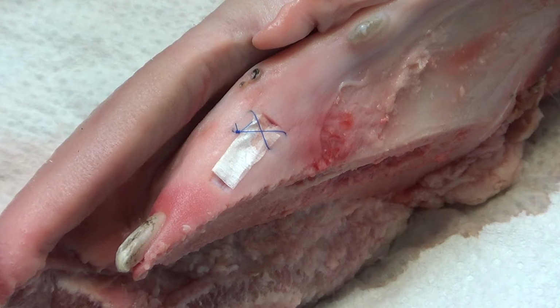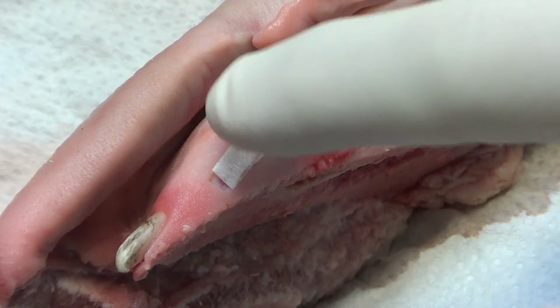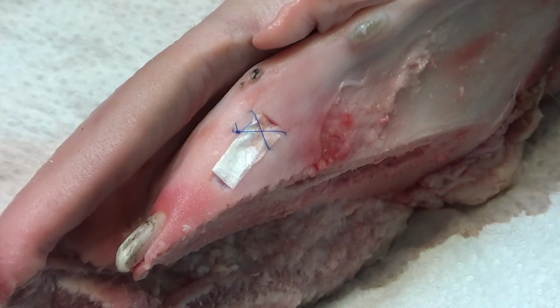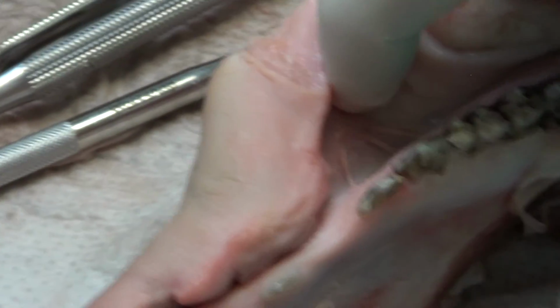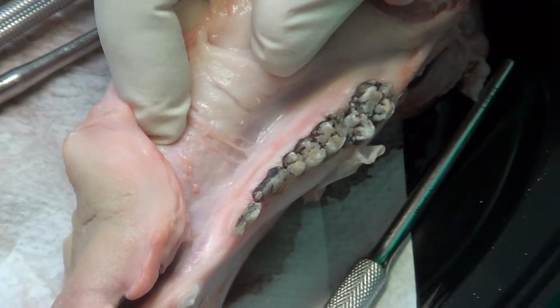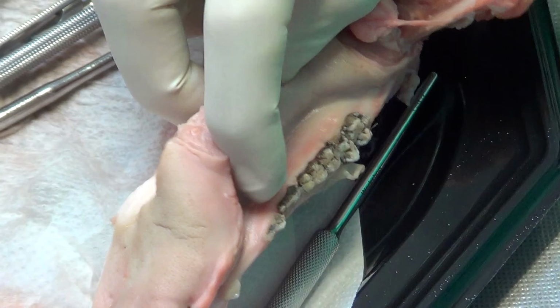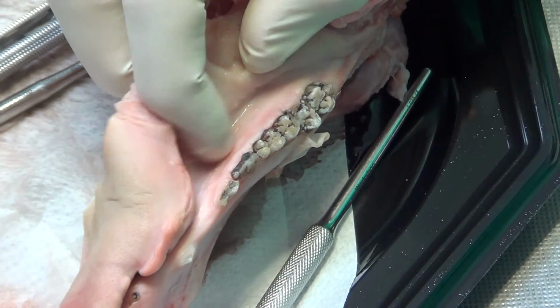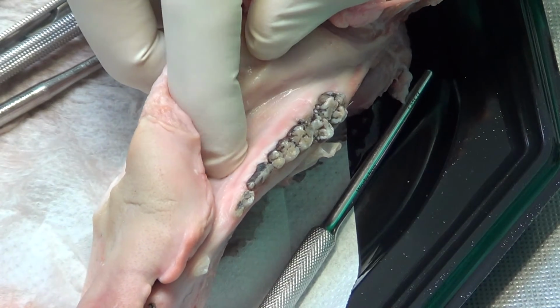We need to work in this region. Now we need to work here. Okay, so we need to work where there is the cheek, in this region. Why? Because you have keratinized tissue and also alveolar mucosa here. Okay?